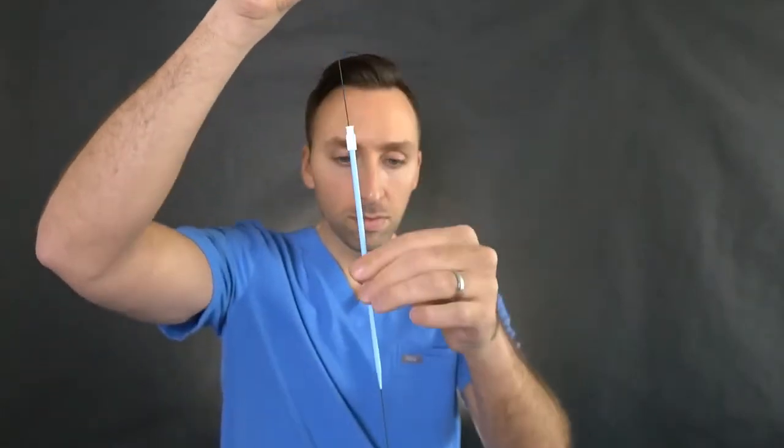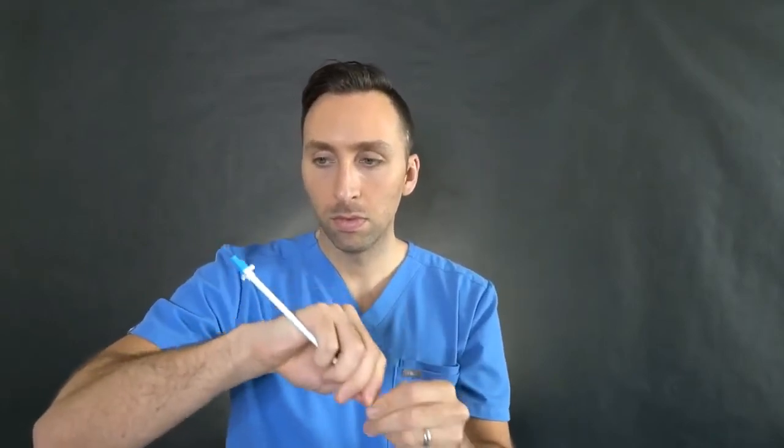Once the tunnel is made, you start dilating your tract at the venotomy site. You put the dilator on the wire, advance it down, and dilate up the tract so this large 15 French catheter can pass through. Once the tract is dilated, you place the peel-away sheath over the wire.